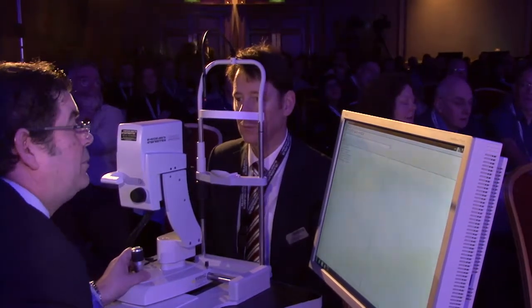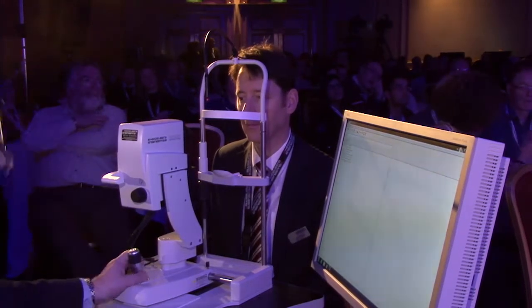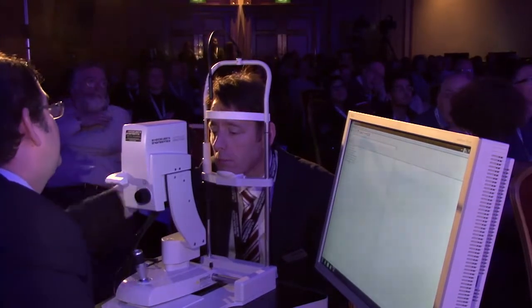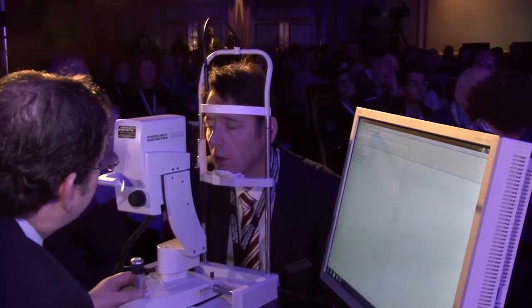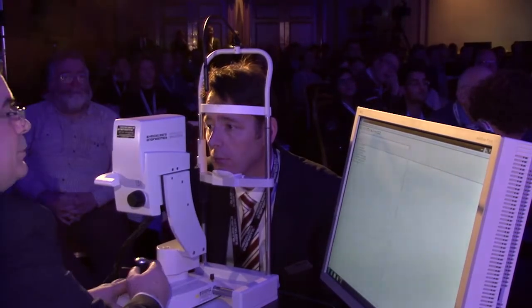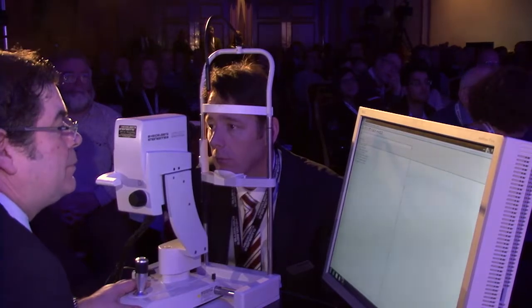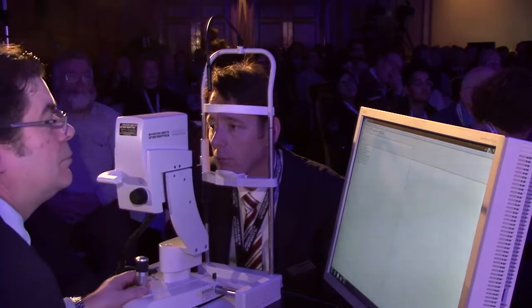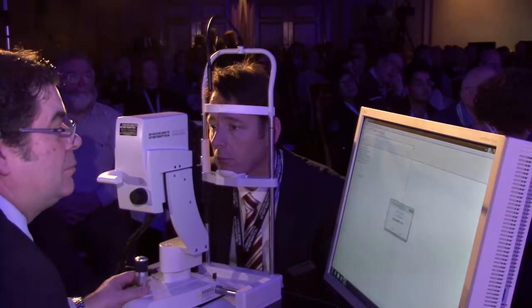Perfect. Okay, so first of all, in trying to set a patient up for any kind of clinical examination, a few moments just getting the patient comfortable and positioned is important. And particularly with OCT, it's very important that the patient maintains a head-forward position throughout the examination. If they don't, they drift away. It's very difficult to maintain an accurate OCT scan position. Okay, if we go over to the live instrument feed now, please.